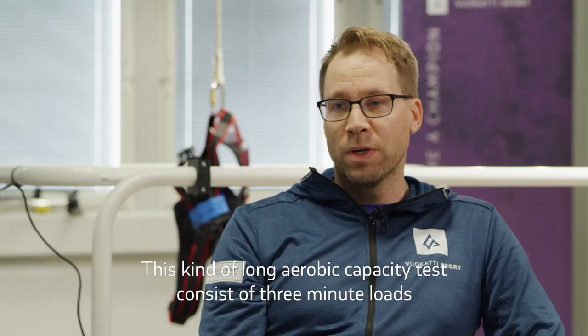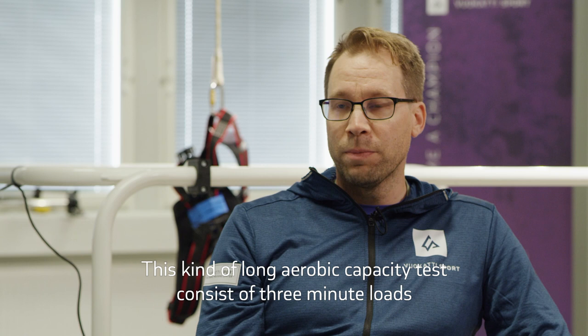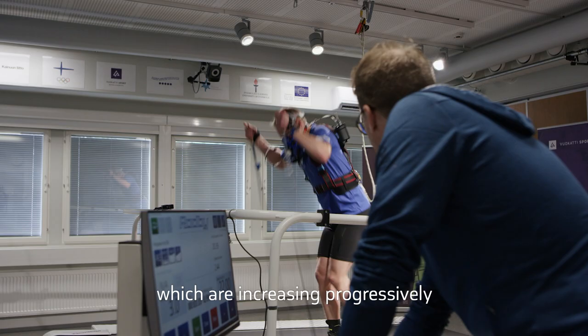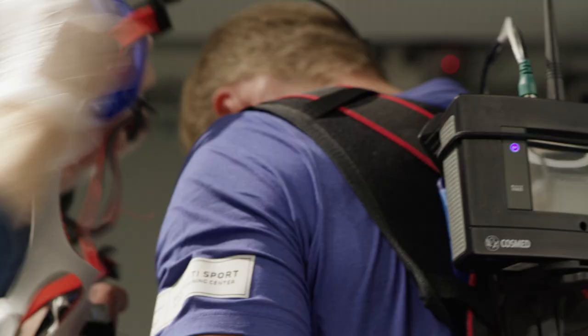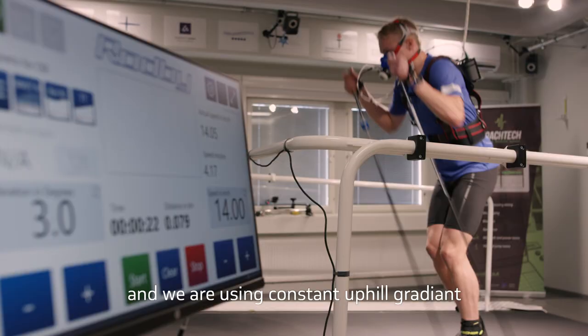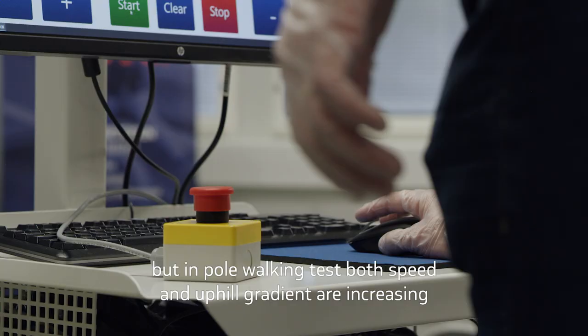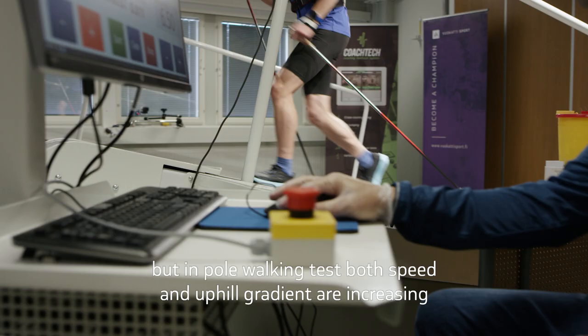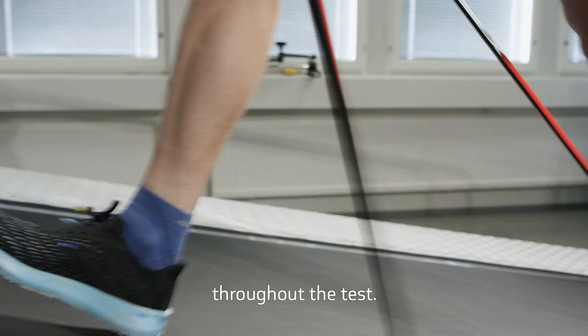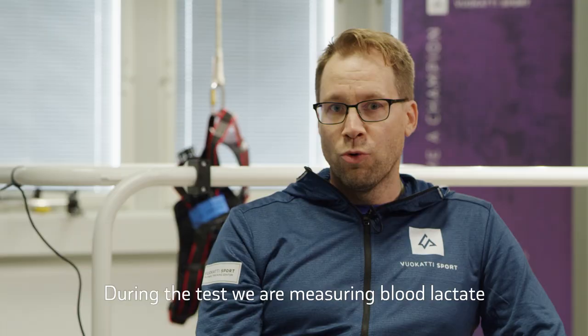This long aerobic capacity test consists of 3-minute loads which are increasing progressively until the athlete is exhausted at the end. In roller skiing protocols, only the speed is increasing and we use a constant uphill gradient. But on the pole walking test, both speed and uphill gradient increase throughout the test.